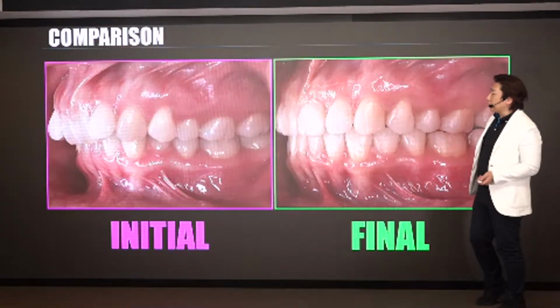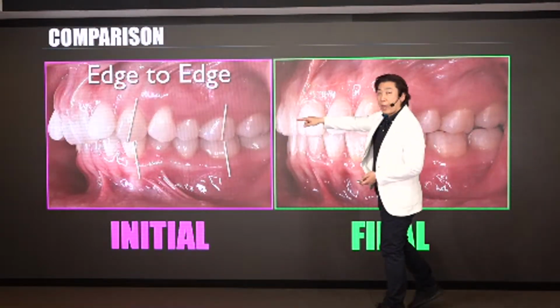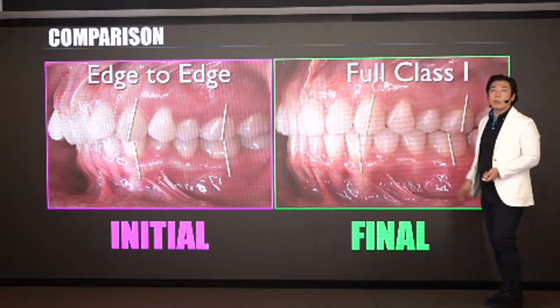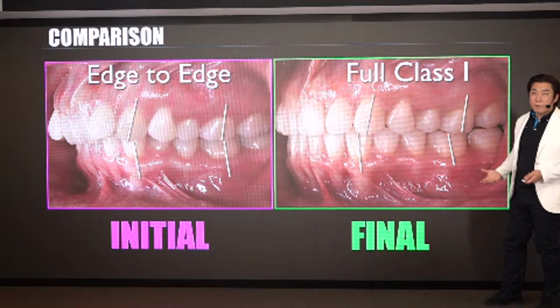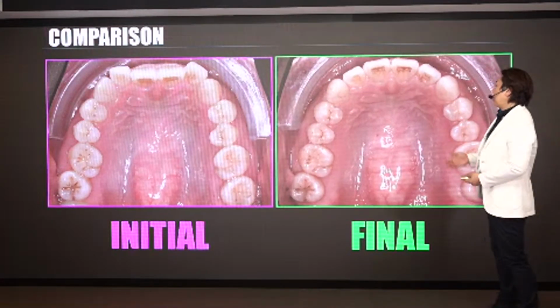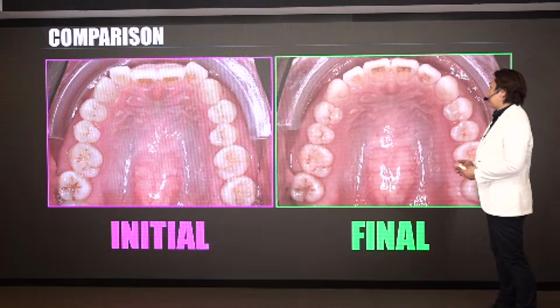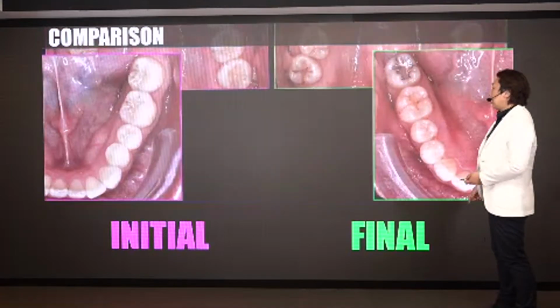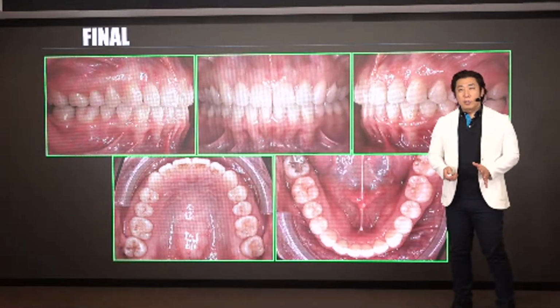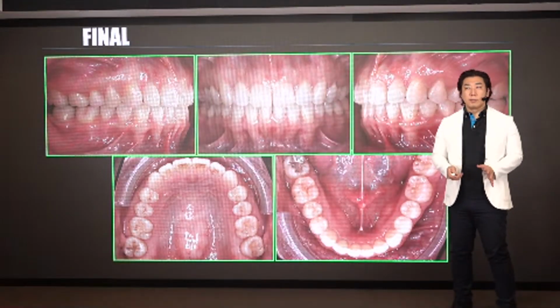This is the left side. Left side is edge to edge for the occlusion, but finally is a definitely class 1 relationship. This is very safe and good for the guidance, and the patient is in a more comfortable position. This is the upper side. This is the lower side. All this treatment is using just aligners.